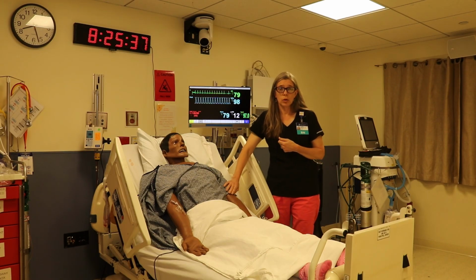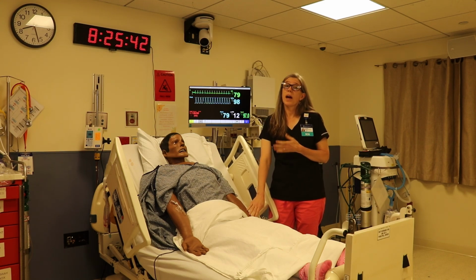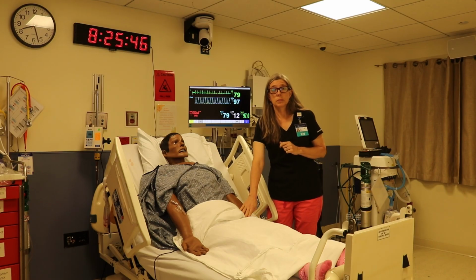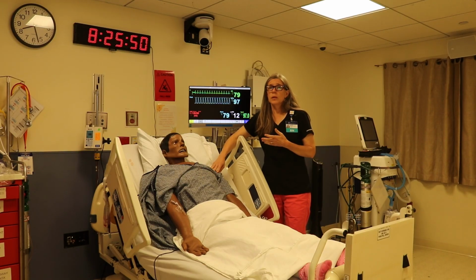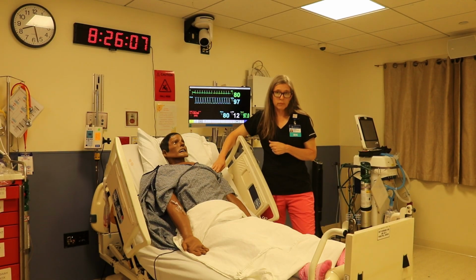And make sure you palpate your pulses, being sure not to press too hard or you may occlude your pulse and not feel a pulse when there actually is one. And a tip, the femoral pulse is the best place to feel a pulse on this mannequin. If you need information or assessment data from the mannequin that is one of its limitations, like we've already described, please verbally state that you're looking for that information, that you're assessing for his response to commands, skin color, etc., and the information will be provided to you.